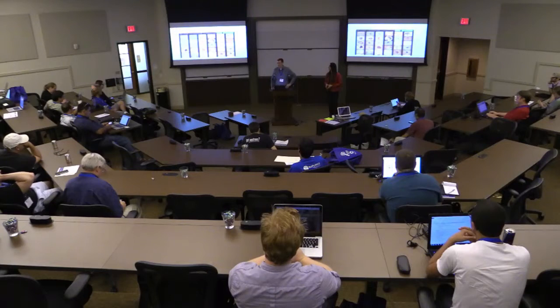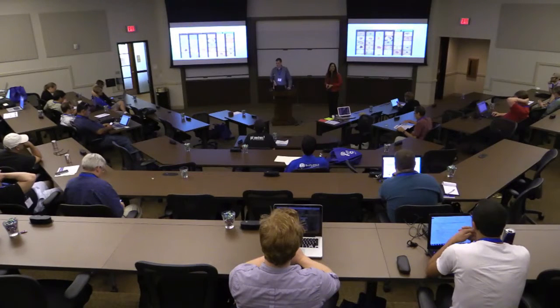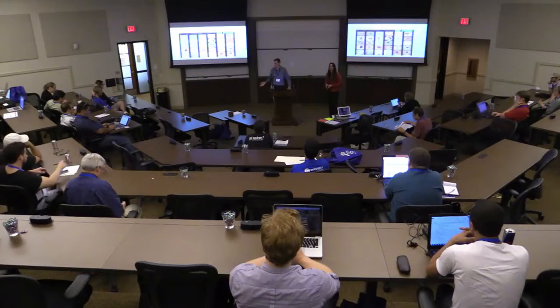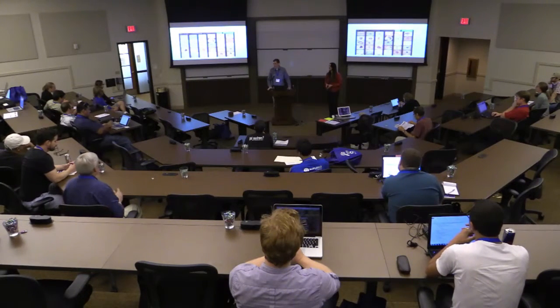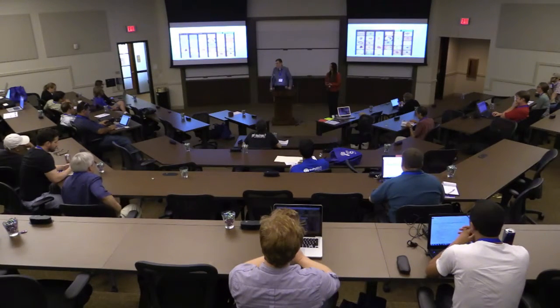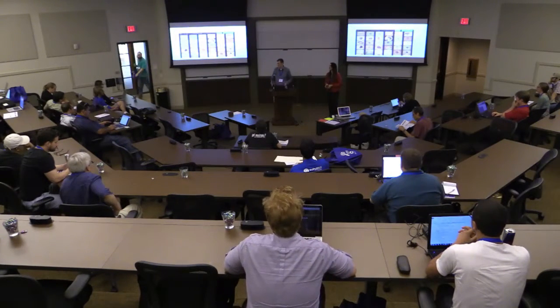At the moment, we want to provide very granular access to these data sets and continue to publicly host them, so that if you run your algorithm and notice certain cases you have a very difficult time processing and successfully identifying the features on, you can go back to your image and look at it and see, oh, maybe it's because it's hairy. But at the moment, it's just data that goes in, data that comes out, and we treat it as a black box.